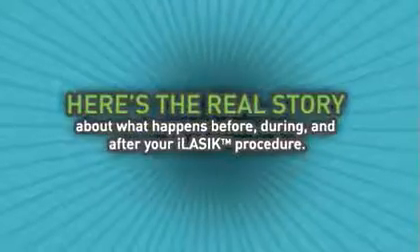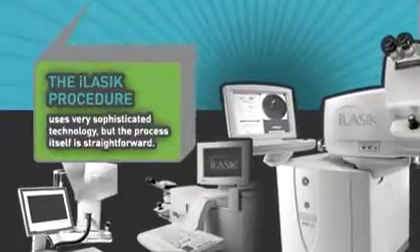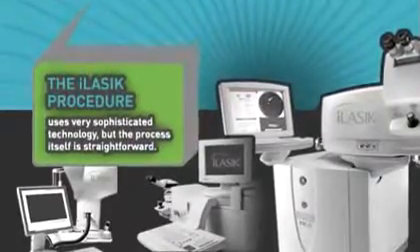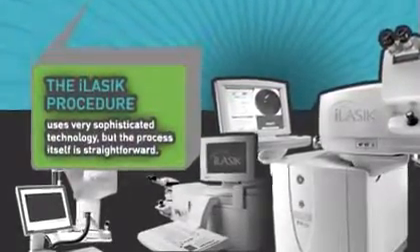Here's the real story about what happens before, during, and after your iLASIK procedure. The iLASIK procedure uses very sophisticated technology, but the process itself is straightforward.